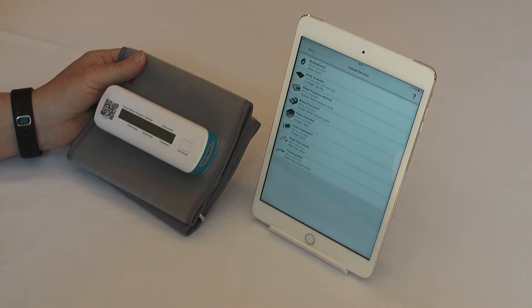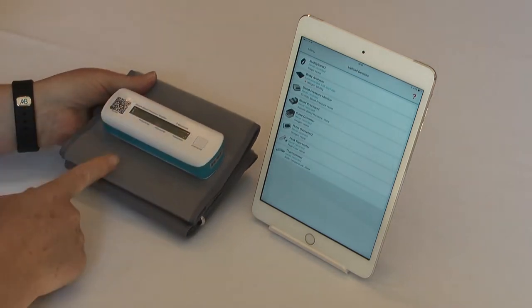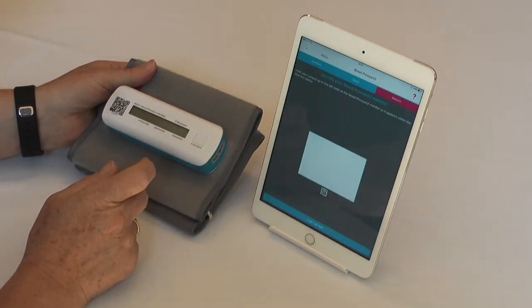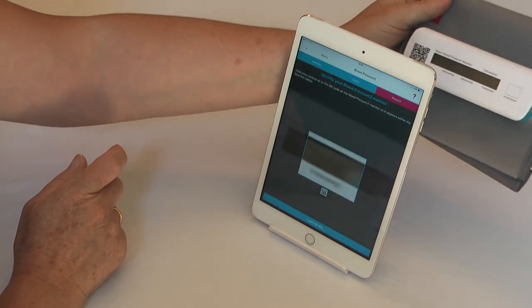Identifying your blood pressure 2 monitor by scanning the QR code on the front of the device enables a more secure connection. So uploading device, press the blood pressure 2 monitor, and place the QR code so that your tablet or phone camera can take an image.